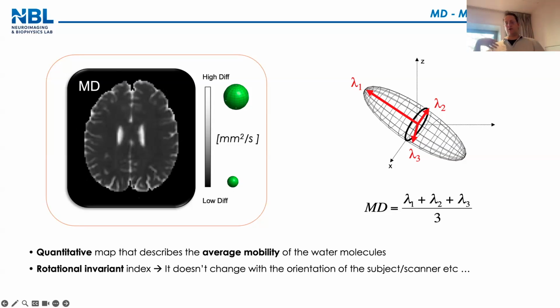So it's monodirectional, or the average of 3 axes. When you do the tensor, you do something different. You have at least 6 DWI, or 30 DWI. You need to measure diffusion in 30 directions in space, because diffusion is, as I said, 3-dimensional. With these 30 directions and let's say 3 or 4 b0, you do again some maths. And what you get, instead of one number like the ADC, is the tensor, this 3-dimensional form, okay?